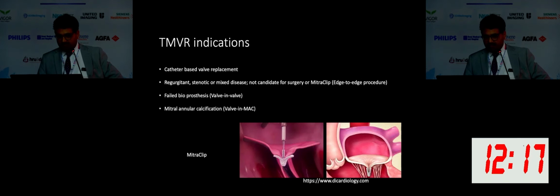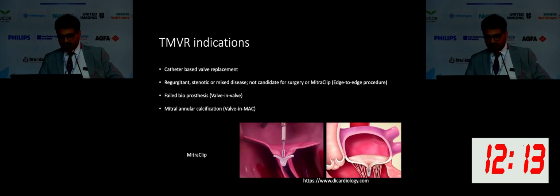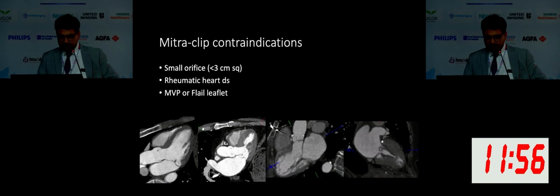I will not cover valve-in-valve much because it's part of another talk. But I'll briefly talk about mitral annular calcification, or valve in MAC, where a dysfunctional valve is associated with mitral annular calcification, which has unique challenges and complications.